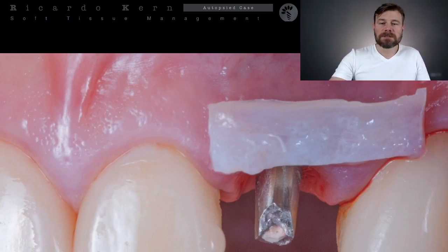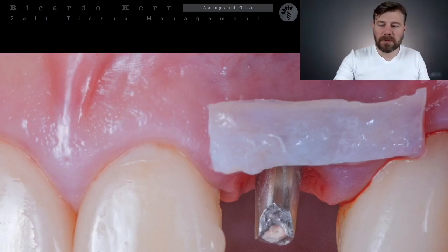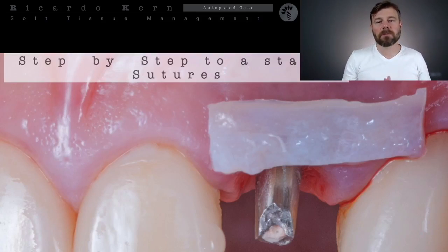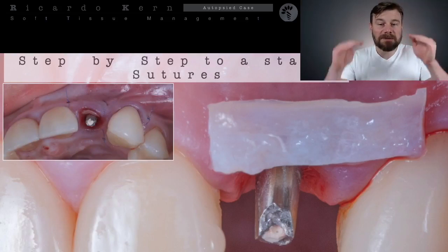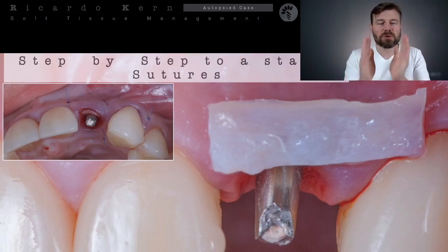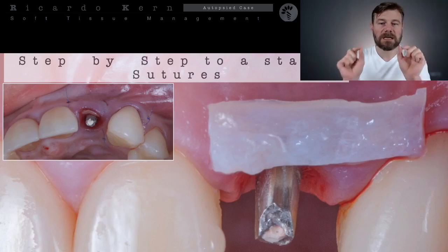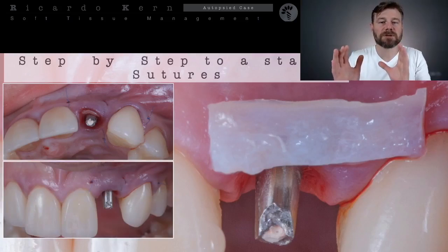Okay, so at the time of the sutures we need to bring and tunnel these sutures inside the area that we just treated. As you can see here, we do not involve the mesial papilla on the grafted area. Why is that? Because I do not need to overgraft this area. And as we don't need to advance the cervical margin coronally, usually we just restrict the area that was tunneled to exactly a size a little larger than my connective tissue.